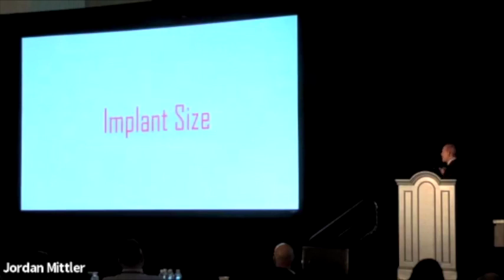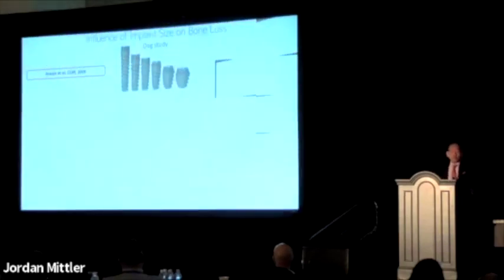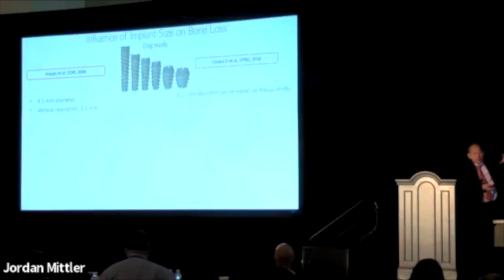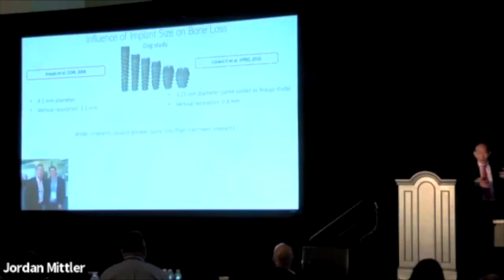And then implant size. We talked about the connection and the bacteria. Implant size is extremely critical. We've evolved also over the years. In 2006, Araujo, who I just lectured with in LA this past weekend, did a study and found that if you place a 4.1 diameter implant into a dog socket, you get about 2 millimeters of vertical bone loss. In 2010, Covani did the exact same study, but decreased the diameter of the implant to 3.25 millimeters, just 0.8 millimeters less. What he found was that the bone loss dropped to 0.8 millimeters. In other words, the smaller implant had less bone loss, and the wider one encroached more on bone.